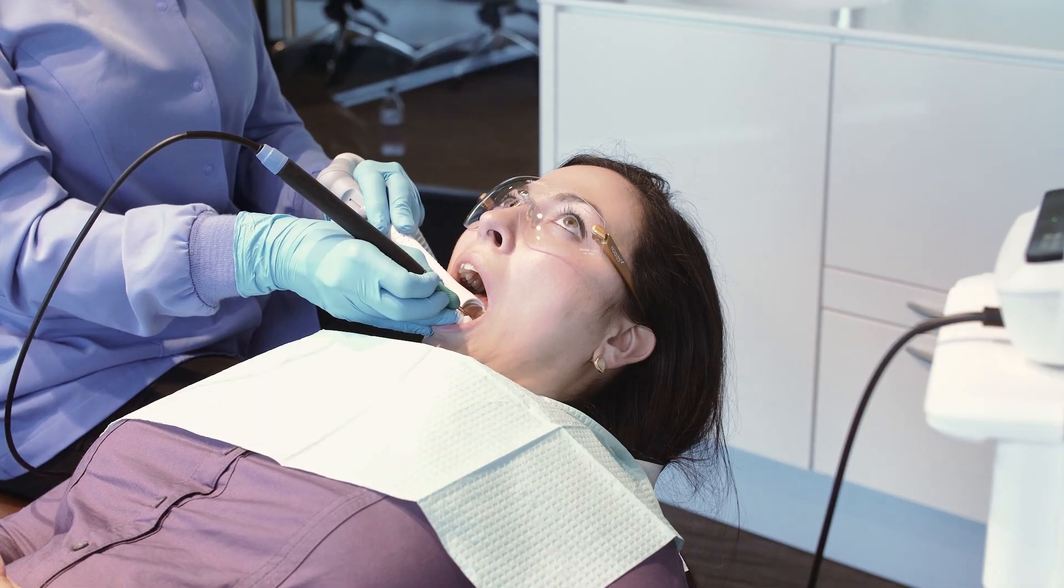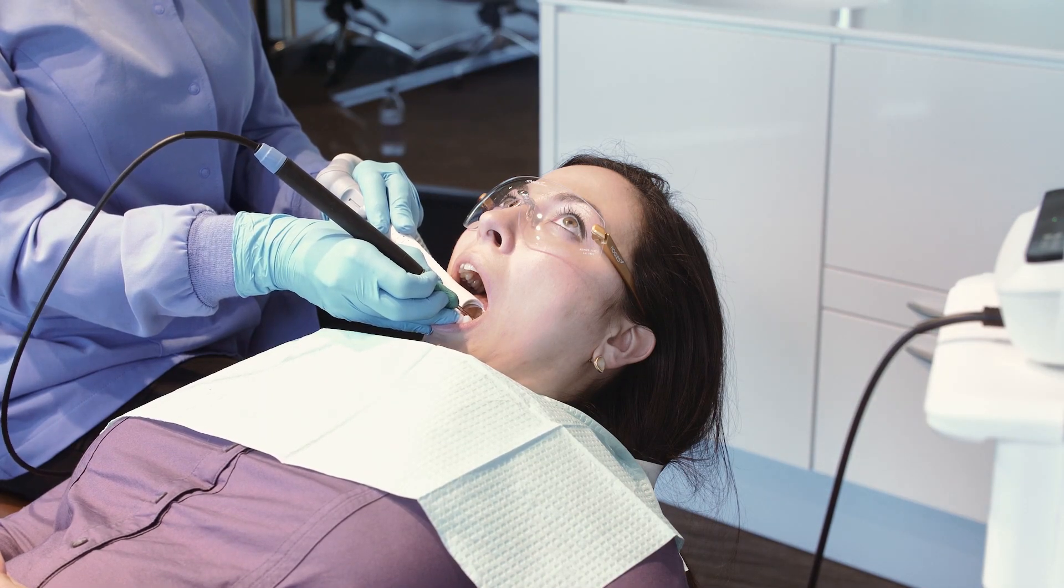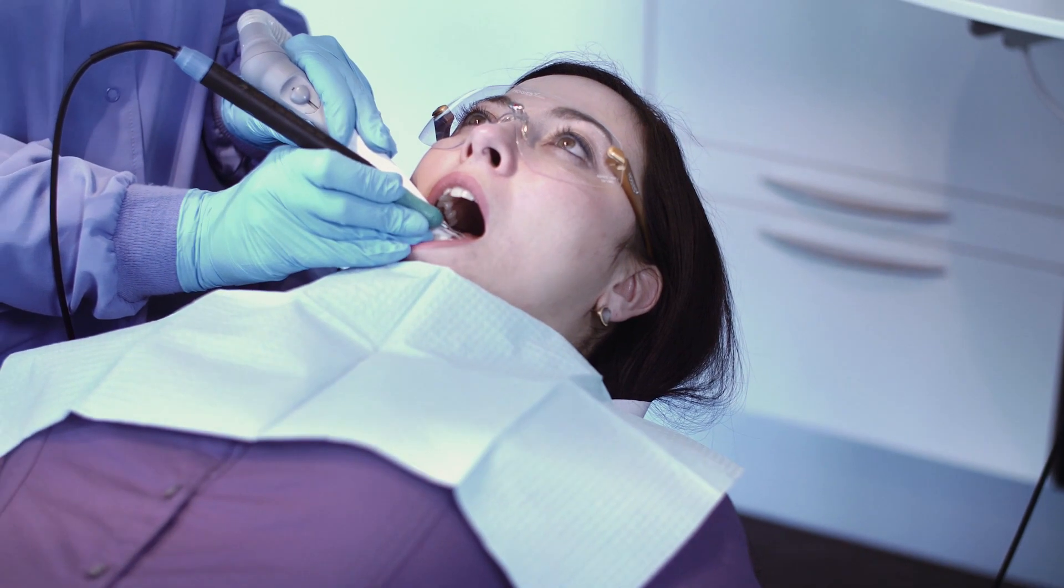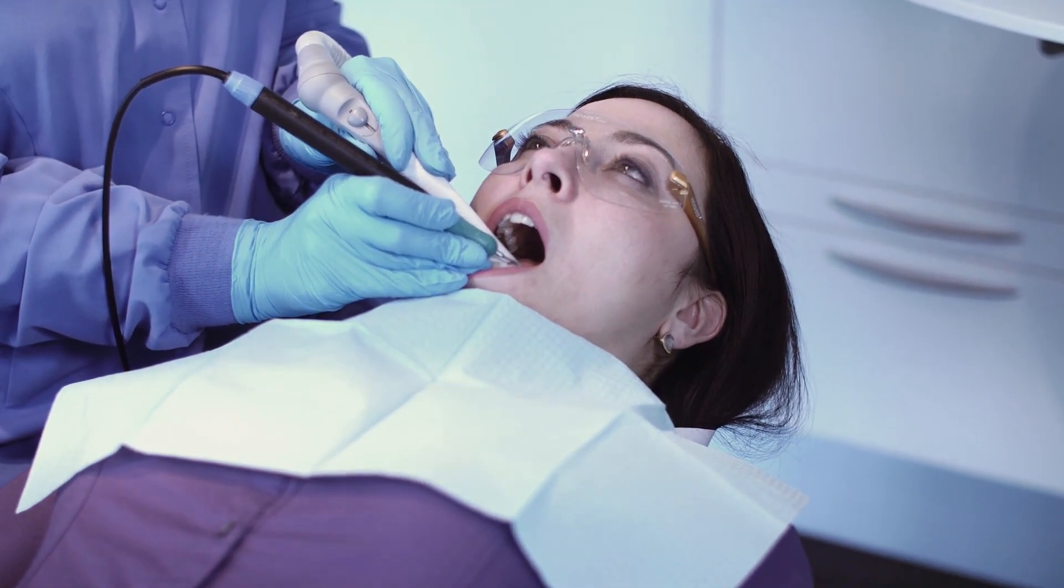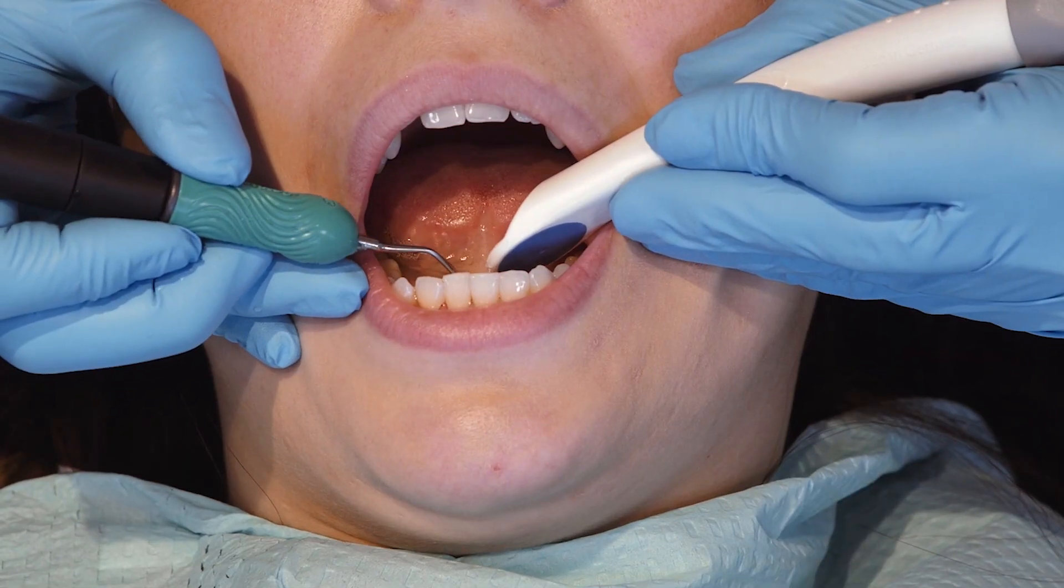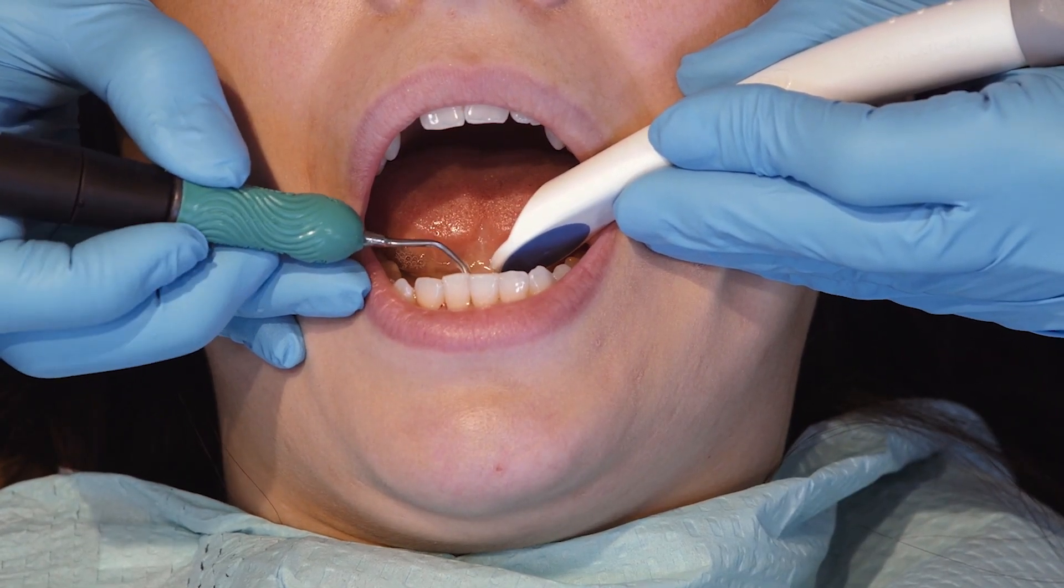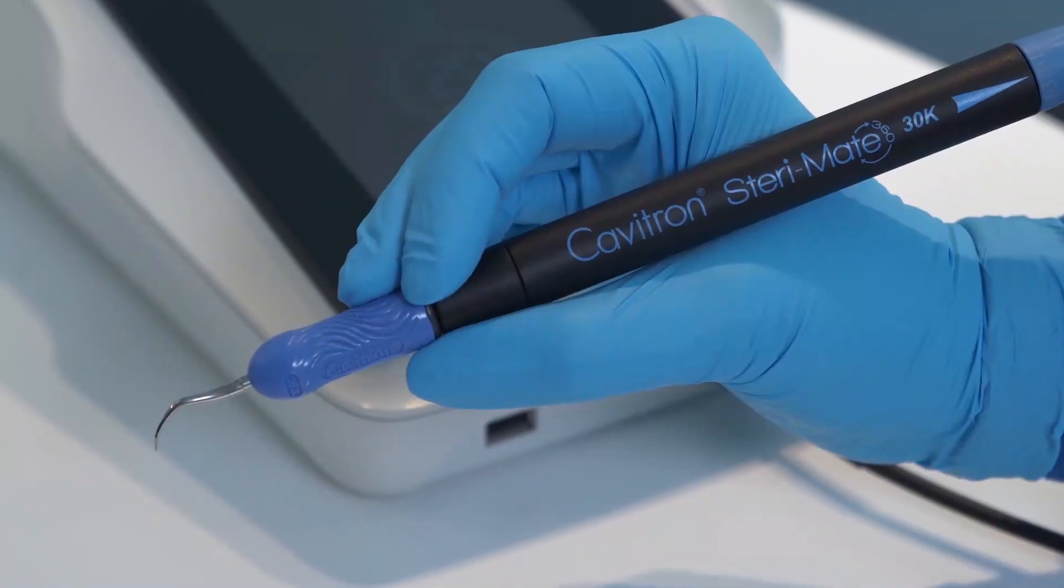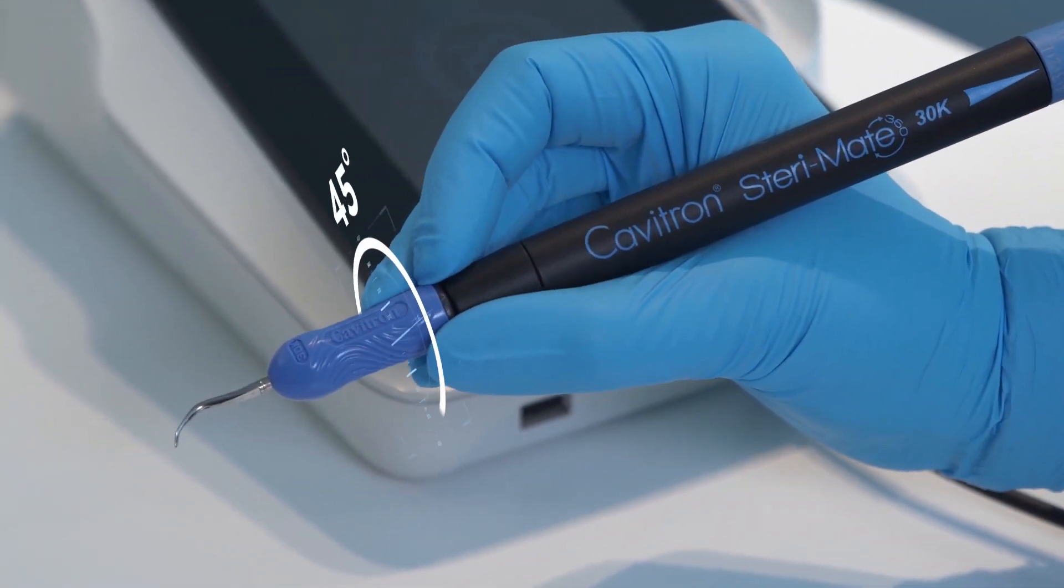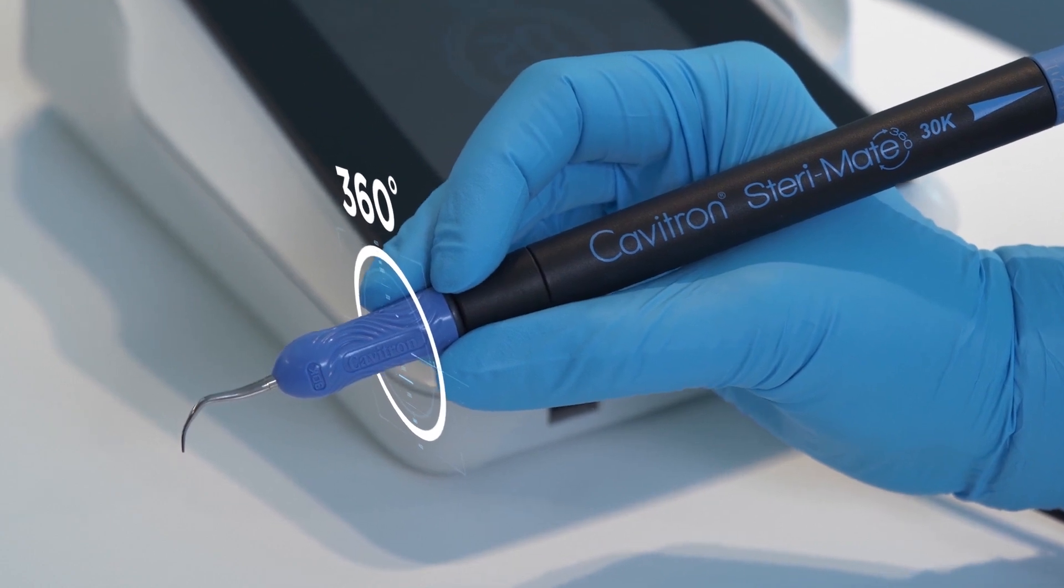The Steramate 360 handpiece provides the clinician the effortless rotation of the ultrasonic insert with their fingertips. This allows adjustable hand positioning, free-flowing movement, and easy access within the anterior and the posterior of the oral cavity. To rotate the ultrasonic insert, place fingers on the nose of the handpiece and rotate to your desired position.